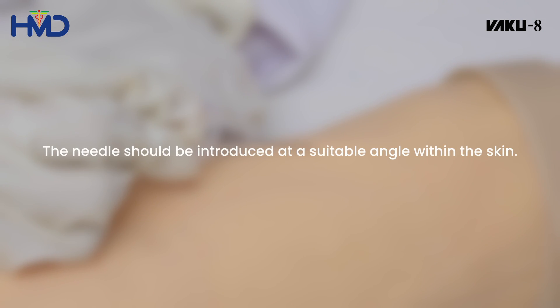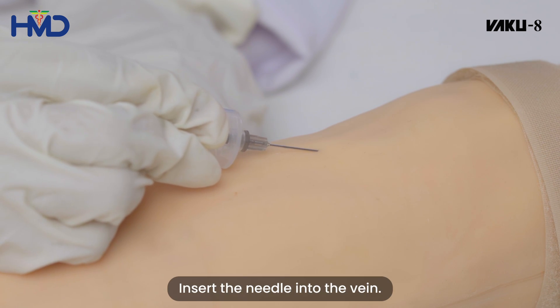The needle should be introduced at a suitable angle with the skin. Insert the needle into the vein.